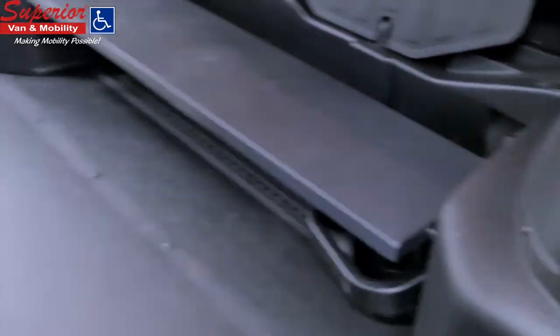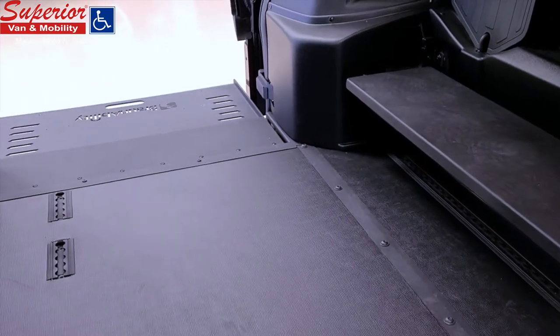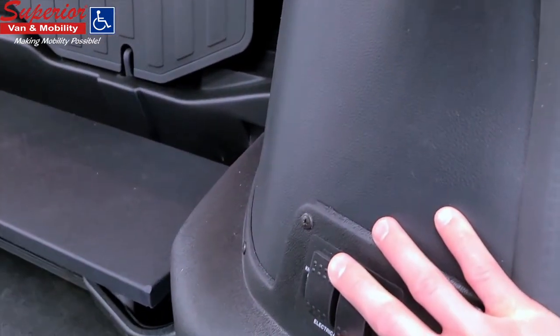In earlier Braun conversions, these buttons may be found near the bottom of the C-pillar, above or on the ramp motor cover.